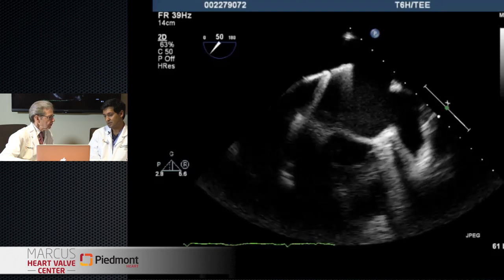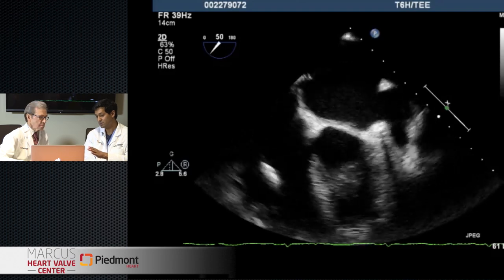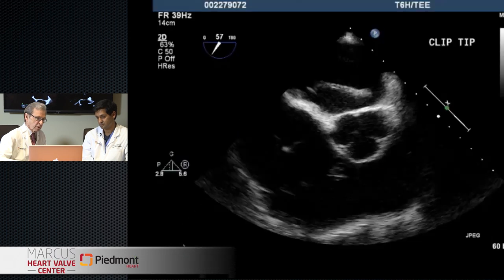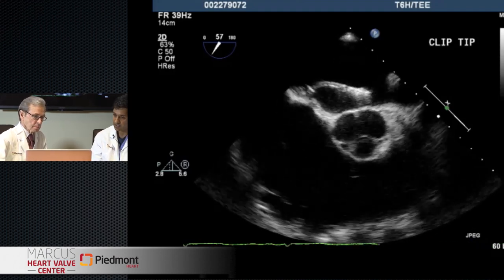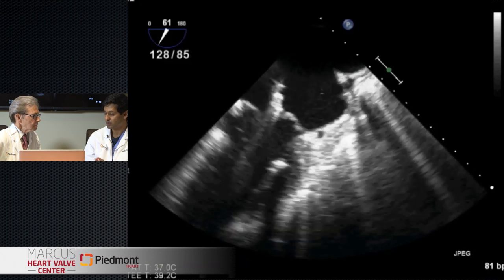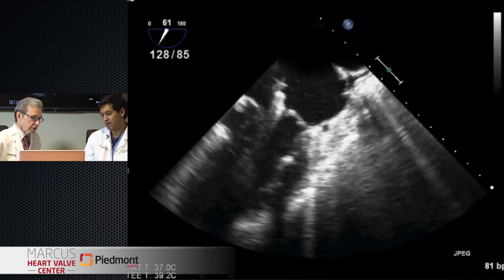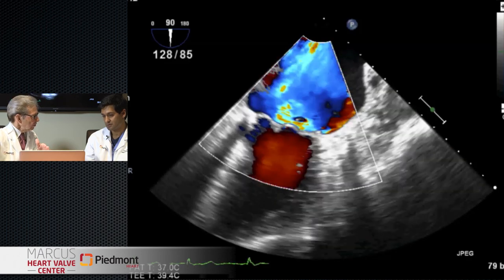The clip is now in the left atrium. We're going to be advancing it until it's in a position that we can steer, keeping away from the left atrial appendage which you see towards the right. Through a series of iterative steps using 2D and 3D echo, we're going to be able to do this safely. Here's another nice 3D view of the device heading toward the mitral valve. It's a little anterior, so we're going to steer the guide more posteriorly. The really neat thing about this procedure is that you can target the clip exactly where your pathology is - you can see where the flail segment is, where the mitral regurgitation jet is, and alter the position of the clip accordingly. With color, you can see the clip is very close to the color jet, right where we want to be.